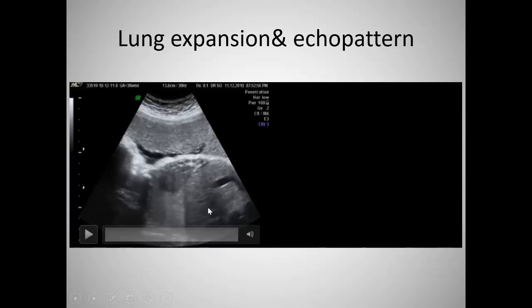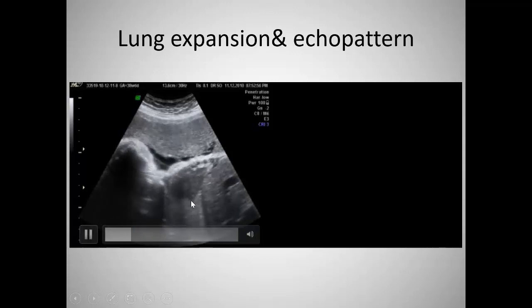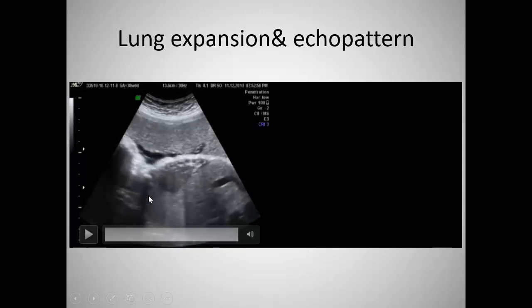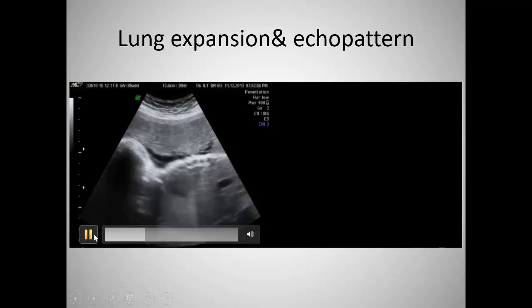Note the difference in echogenicity is outstanding, even if we did not measure by the measure that I will mention later in the lecture. So here, this is the lung and this is the liver, and the lung is more echogenic than the liver. And then when you see the chest, here the chest with the abdomen are in one line. So here the chest is a good expanding chest. This is the thymic gland and the atrium, and this is the thymus. And this is the lung. So this is how the lungs are perfectly expanding in this fetus.